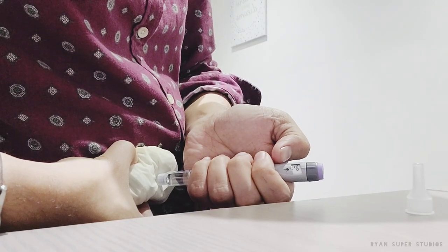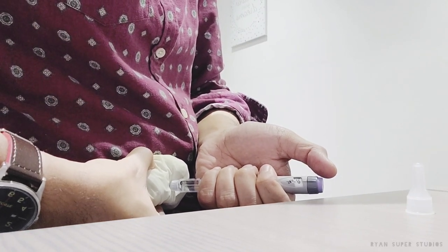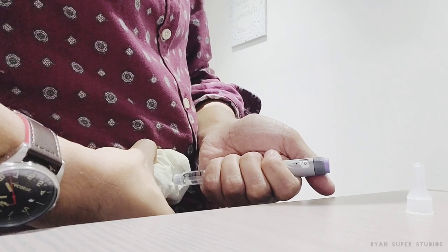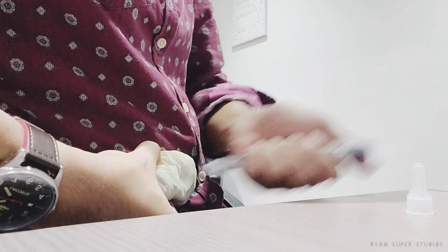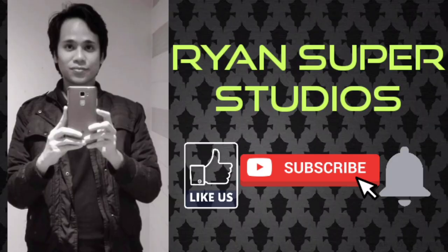Once you see number zero in the window, count from one to five to ensure there is no insulin leaking out from the needle. That's it — you've given yourself the full dose of 10 units of insulin. Then pull the needle out.